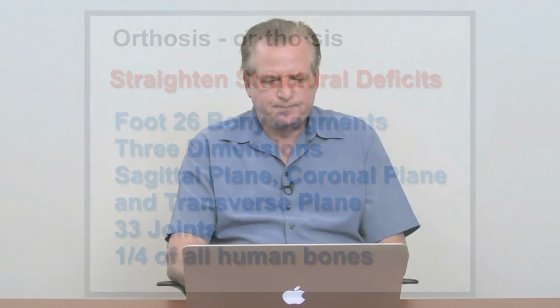Shoes is another whole subject, but we need to make sure the shoes for orthoses, for lower extremity orthotics, need to be wider and deeper, which prevents the length from growing on a shoe. The other part that's very important is the waistline of the shoe, and we'll get into that as well in the recommendations for shoes in the future.